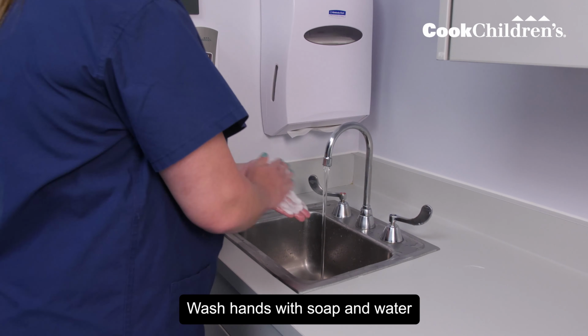It is important to take care of the skin around the G button. Clean the skin every day or more often if needed. You can do this at bath time, in the bathtub, or in the shower. Follow these steps to clean the skin. First, wash your hands with soap and water.